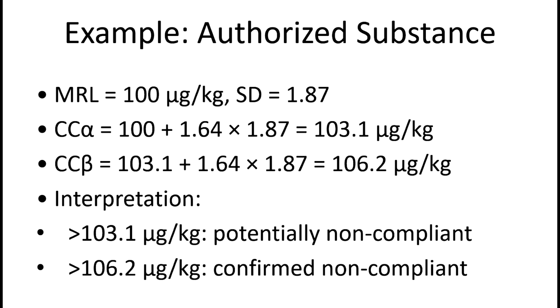But as I said before, for authorized compounds with a very high maximum residual limit, you don't need to calculate CC alpha and CC beta, but if you follow this European guideline, you have to evaluate them.